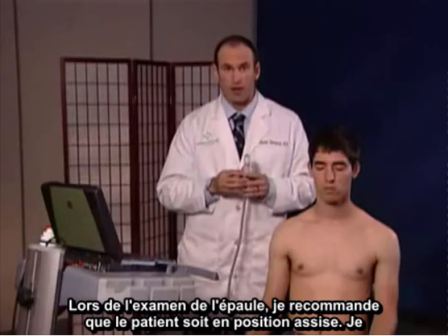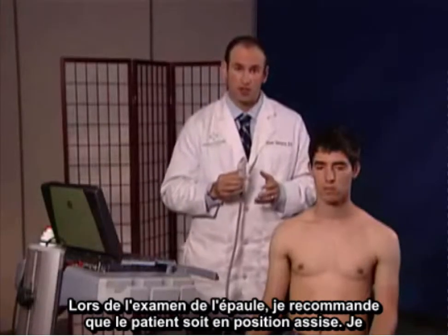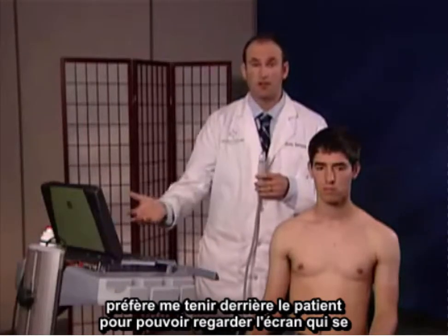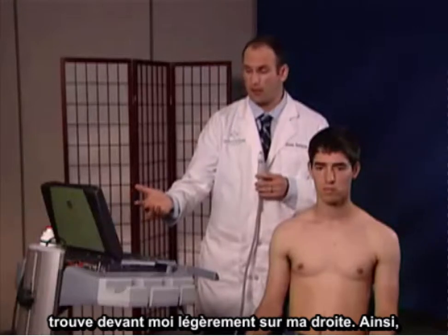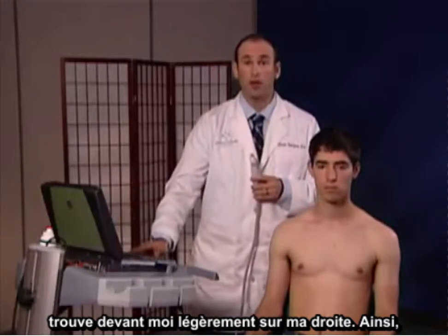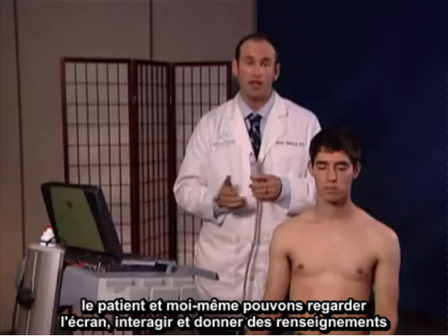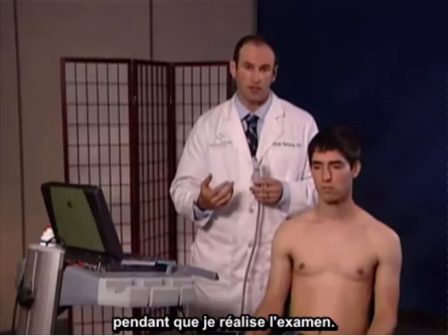In looking at the shoulder, I recommend that the patient is in the seated position. I prefer to stand behind the patient so that I can look at the screen, which is in front of me at approximately a two o'clock window, so that the patient and myself can both look at the screen and interact and educate the patient while I'm doing the scan.